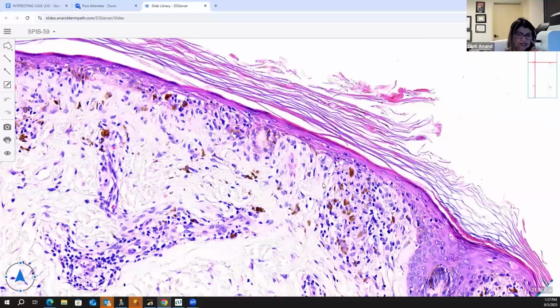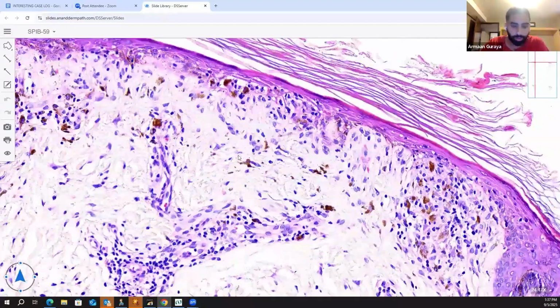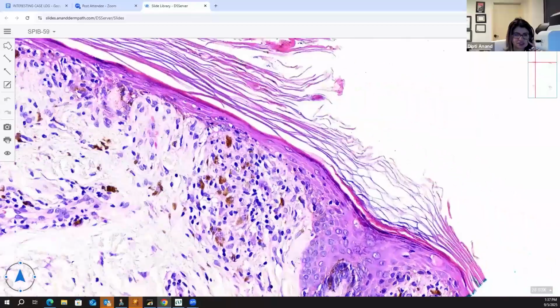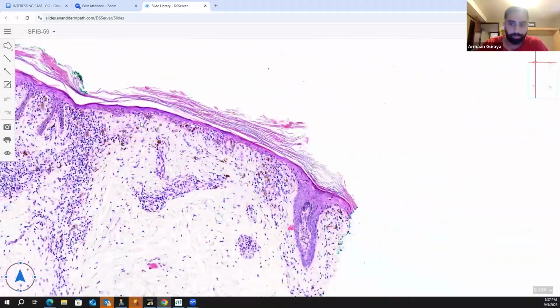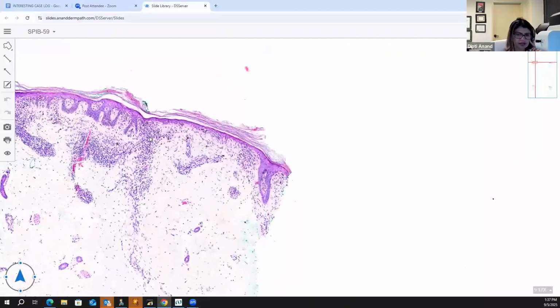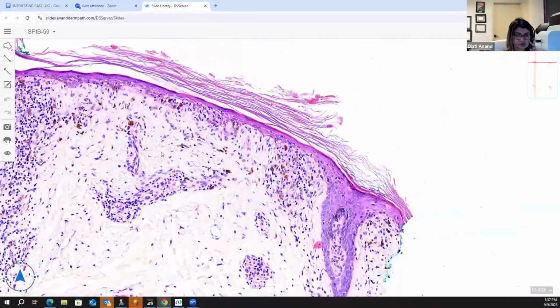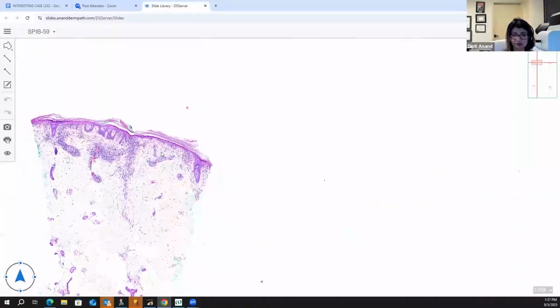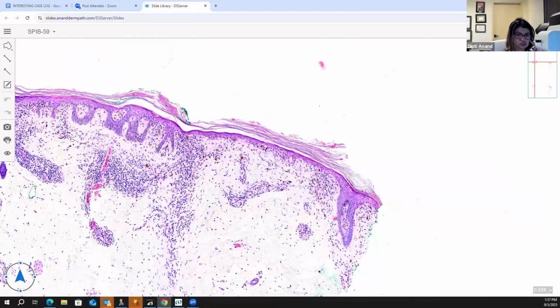Okay, yeah, but fixed drug wouldn't do this, right? It wouldn't be as chronic, it would be atrophic, and this is all your thick basement membrane in here. So this is probably a connective tissue disease. Yeah, it could be lupus or dermatomyositis, and honestly, it is very difficult to tell both of them apart. And honestly, I don't even remember what disease this patient had, either lupus or DM.